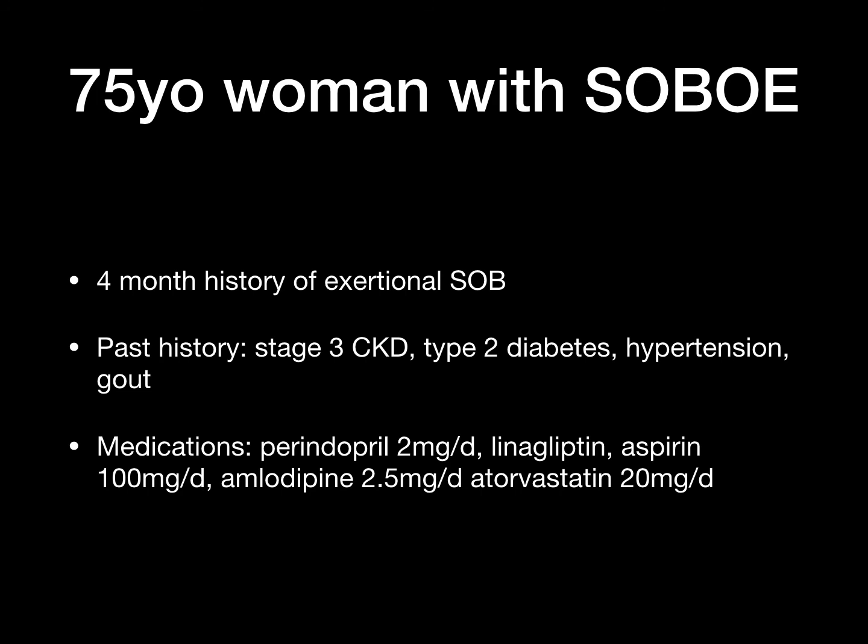And in some situations like this, one might even consider angiography, but you would need to be very careful because of this lady's stage 3 chronic kidney disease and the risk of the dye that we use for the angiogram causing further renal dysfunction. But in essence, the left bundle branch block in this situation adds substantial additional weight to a cardiac etiology for her symptoms.